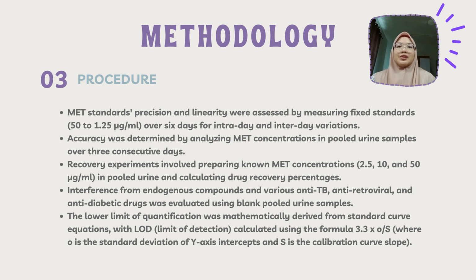Next, recovery experiment involves preparing known metformin concentrations in pooled urine and calculating drug recovery percentage. Interferences from endogenous compounds and various anti-TB, antiretroviral and antidiabetic drugs were evaluated using blank pooled urine samples. Lastly, the lower limit of quantification was mathematically derived from the standard curve equation, with LOD calculated using the formula 3.3 multiplied by σ over S.